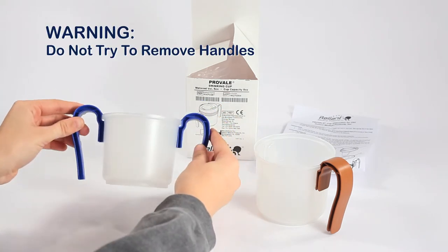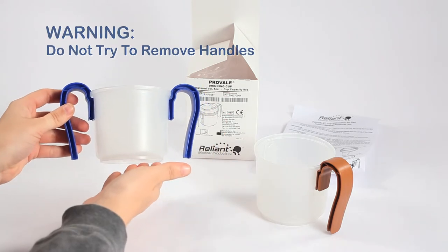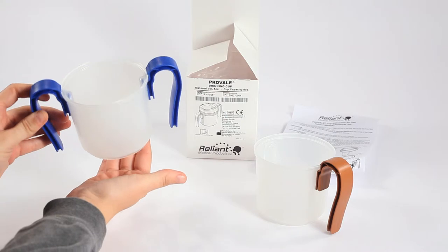Note: the handle is designed to be permanently attached to the cup. Once assembled, do not attempt to remove it. Attempting to remove handles after attachment could damage the cup and cause it to malfunction.